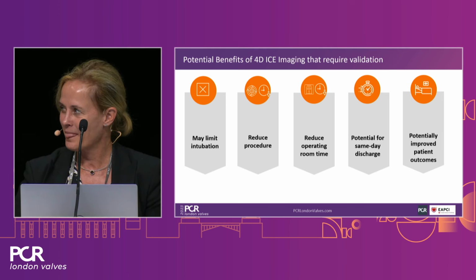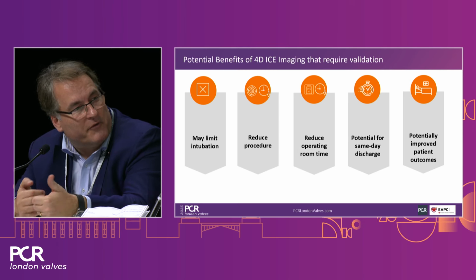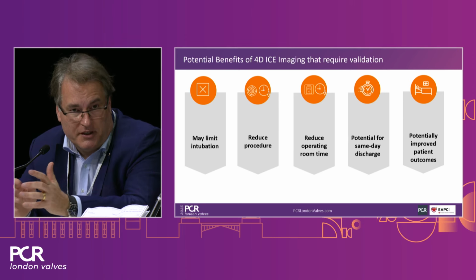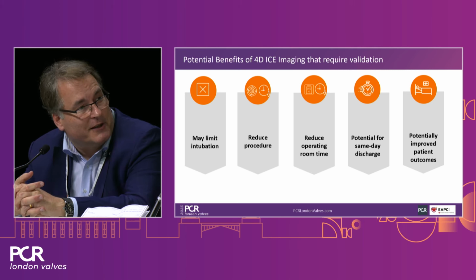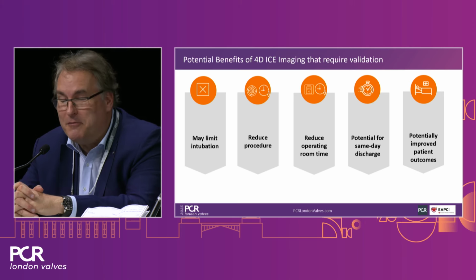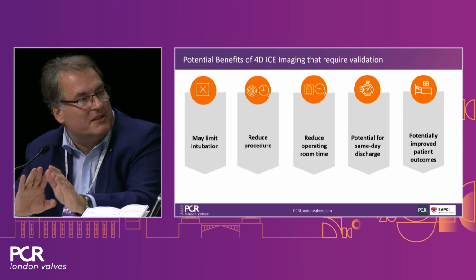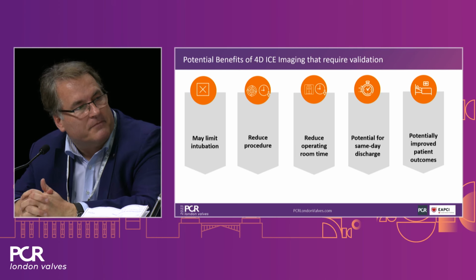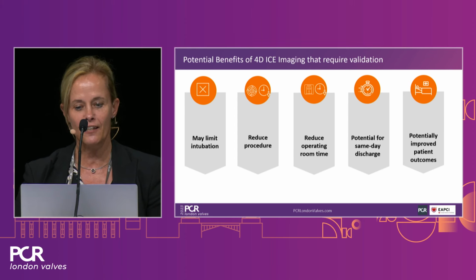I think with additional imaging methods, it will become possible. We haven't done it yet, so you always start from a very secure and very conventional position. But I think we have also done perhaps 3% of our mitral and tricuspid interventions conscious, actually. If there was no anesthesiologist showing up, we also did this with no or minimalistic sedation. It's also possible. It's not my preferred method, to make this clear, but it's a possible scenario for the future.